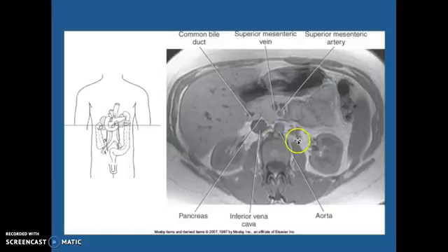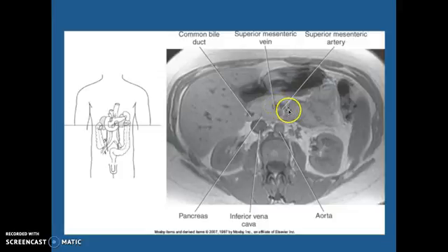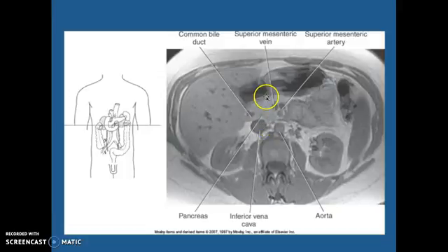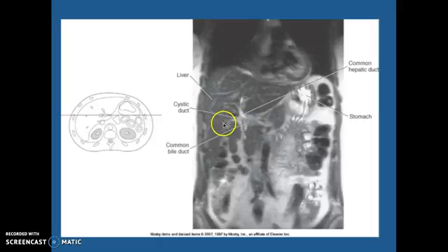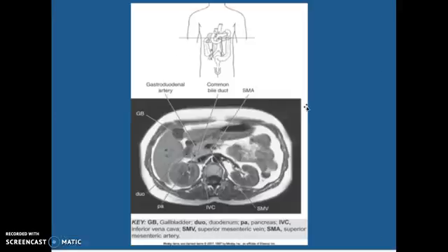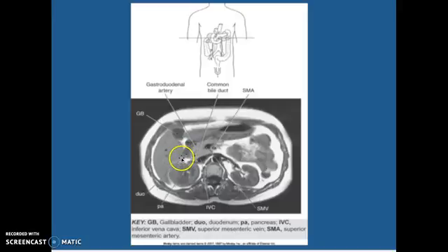Looking here, we have the common bile duct, superior mesenteric vein and artery with your aorta, your inferior vena cava, and this is your pancreatic head right there. This is a coronal MRI T2. You can see your common hepatic duct, your cystic duct coming off here, here's your common bile duct. This is your stomach — we're going to pick up a lot of fluid from the stomach. Superior mesenteric artery, superior mesenteric vein, here's your aorta with your inferior vena cava, your pancreatic head, your duodenum there.